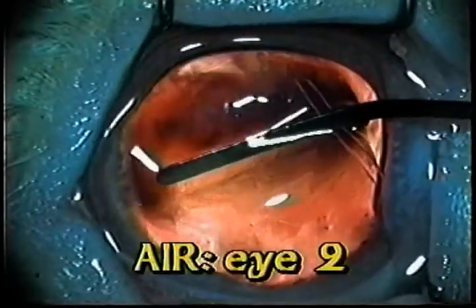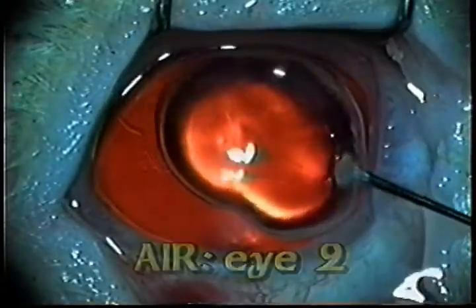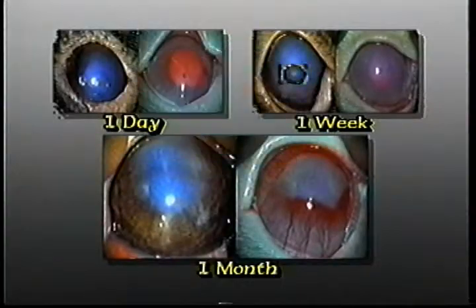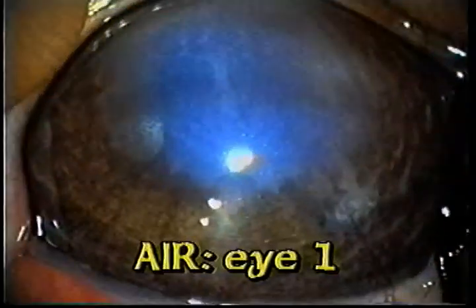In the first two eyes, we will try the Sparks Descemet's opexia with air only. Let's have a look at the two rabbit eyes on which I did that — one day, one week, and a month after.